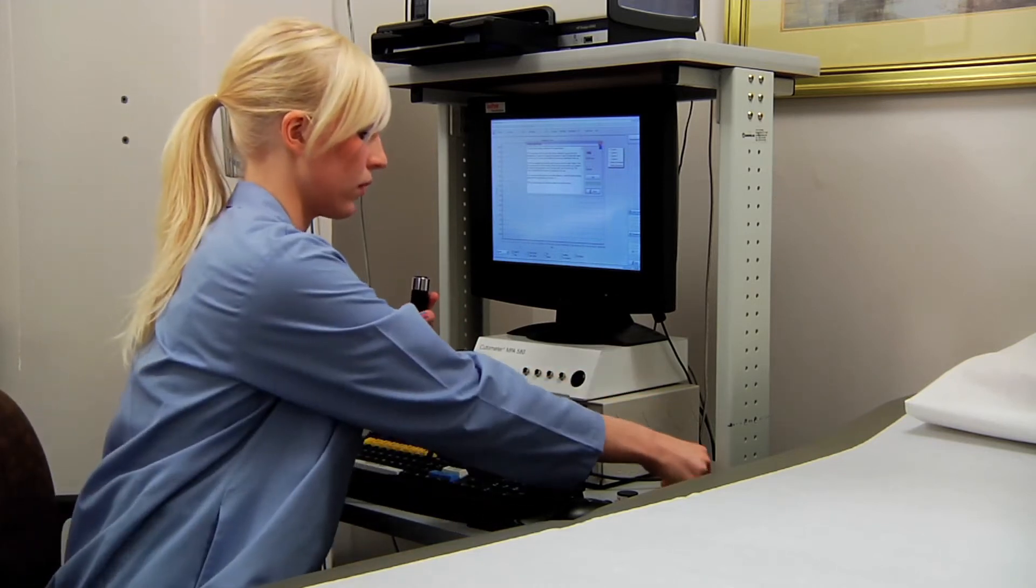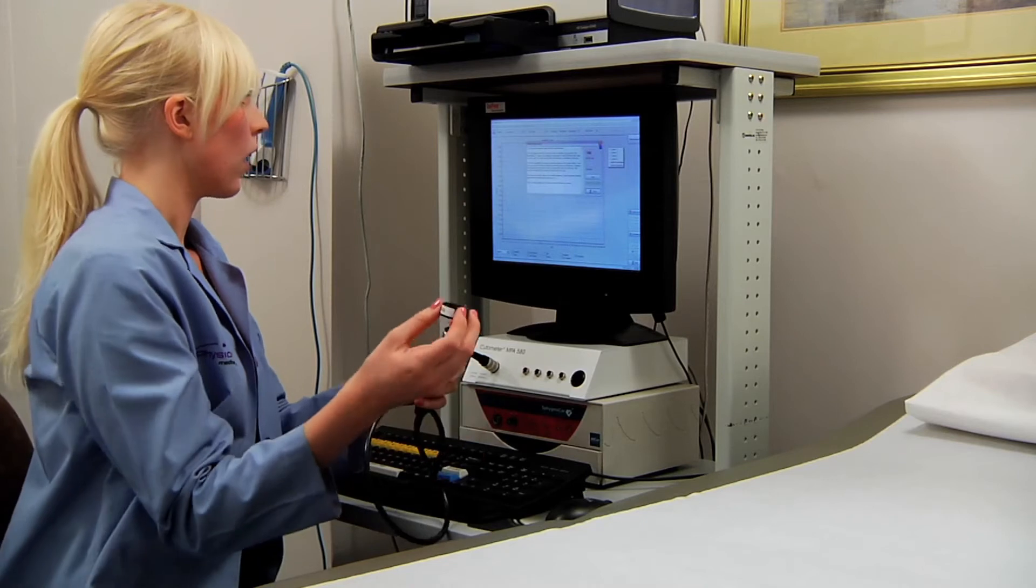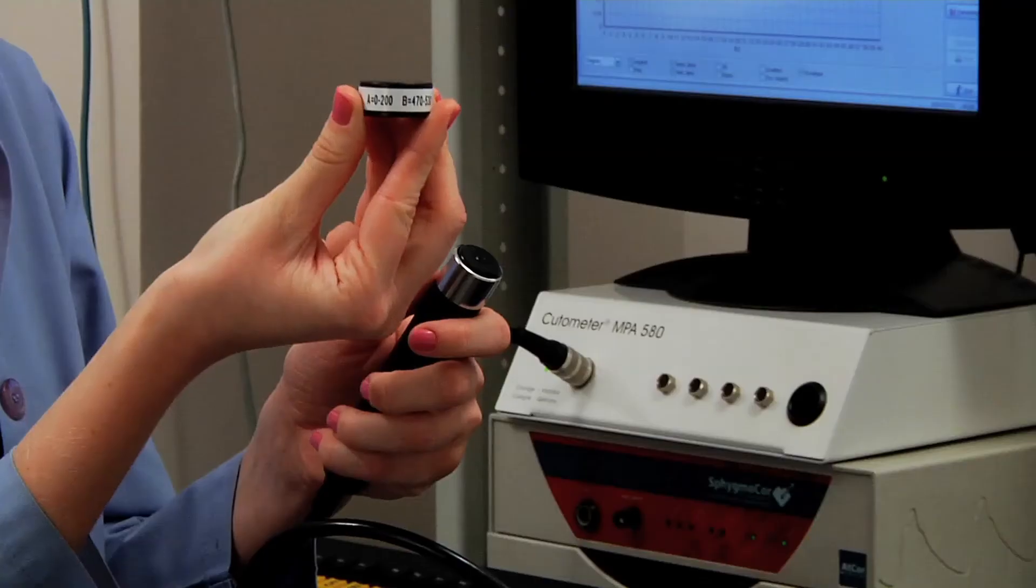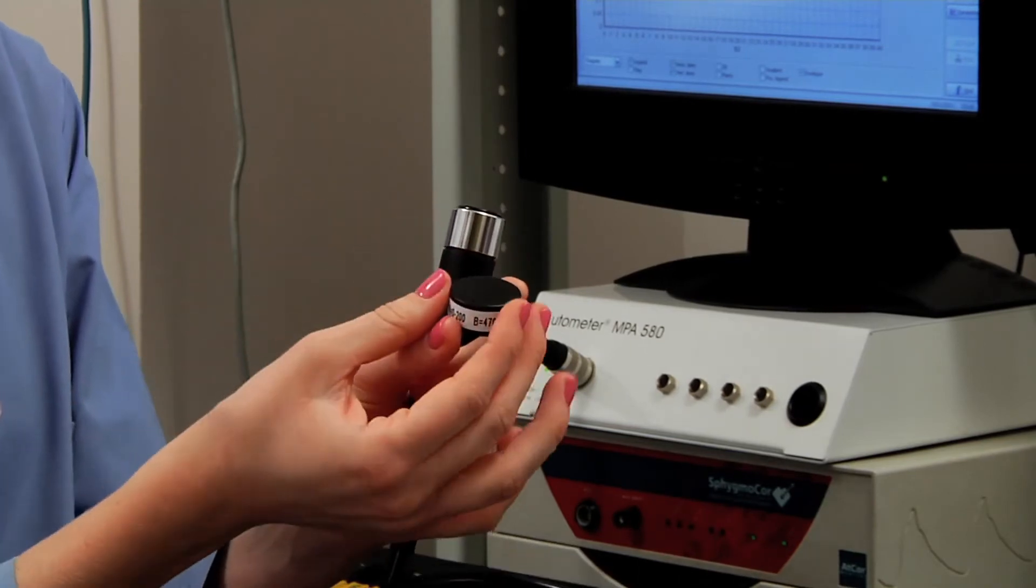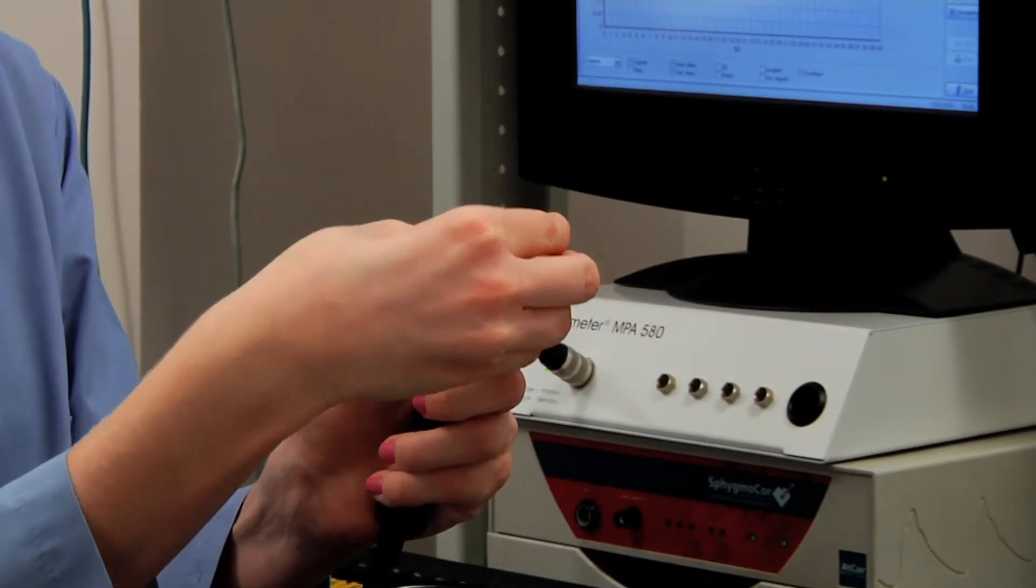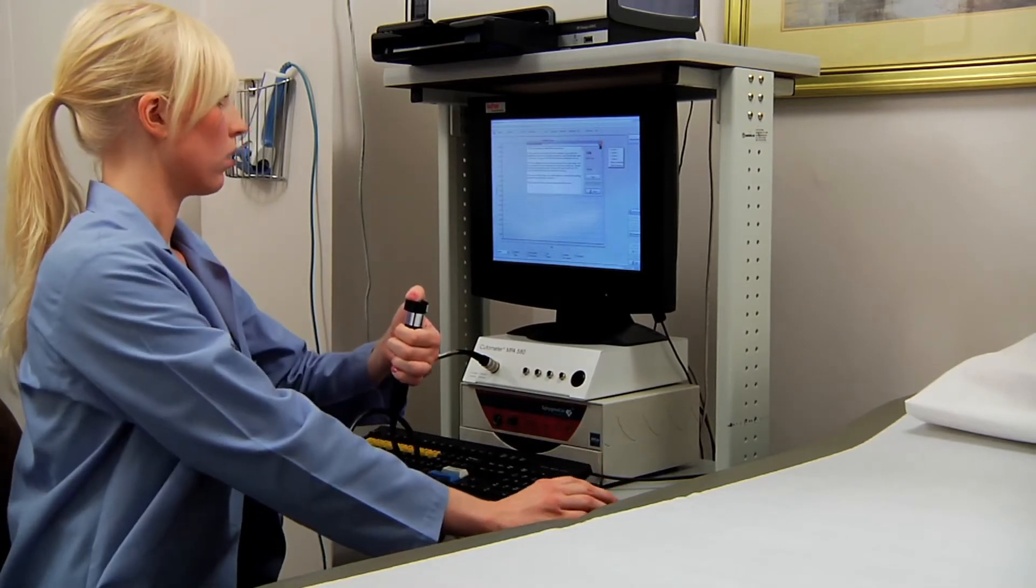As soon as you do that, you're going to put the probe on the flat side of the check calibration cap. This is the check calibration cap. You're going to put the flat side here on the probe and you're going to hold it down. You're going to keep pressure on there. Hit the start button and you're going to wait for it to calibrate.